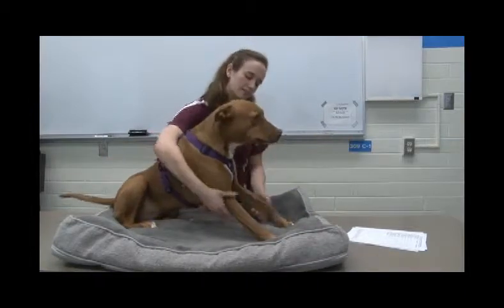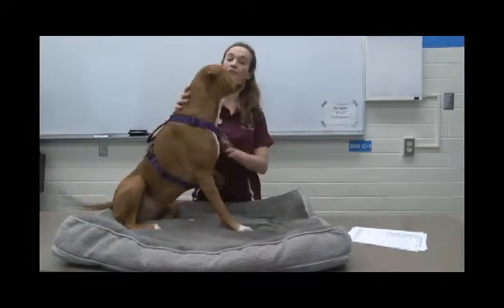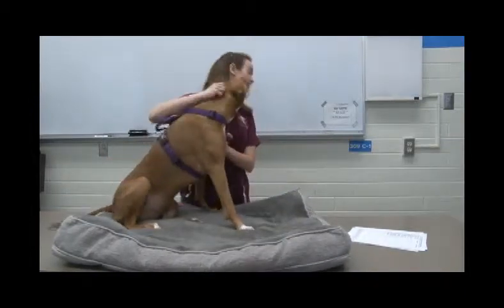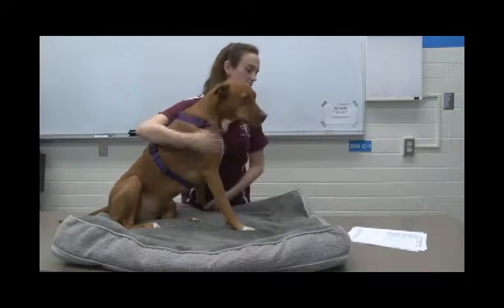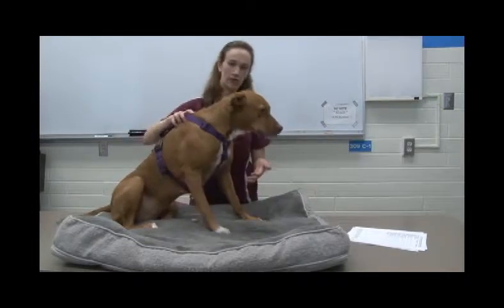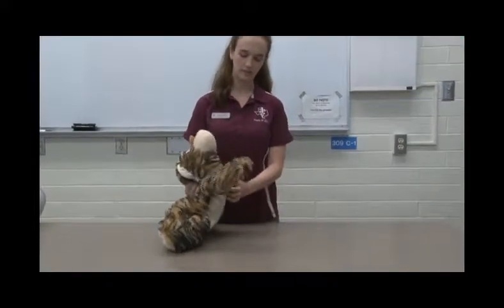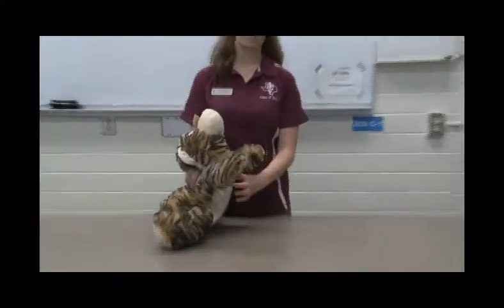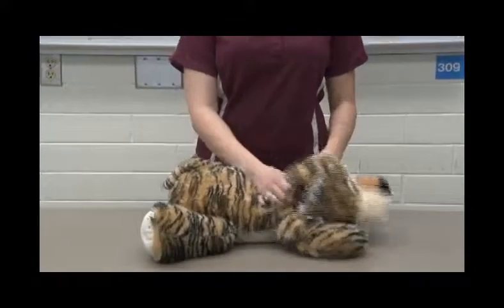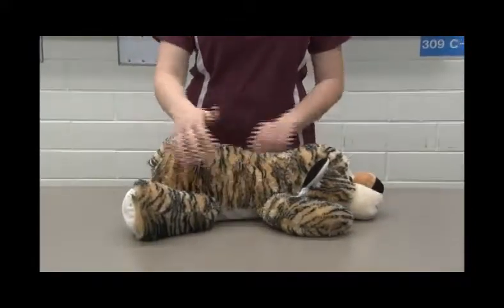First, you're going to say that you are going for the cephalic vein, and then you are going to put the animal in sternal recumbency. Sternal is where the sternum or breastbone of the animal is touching the table — something like this.